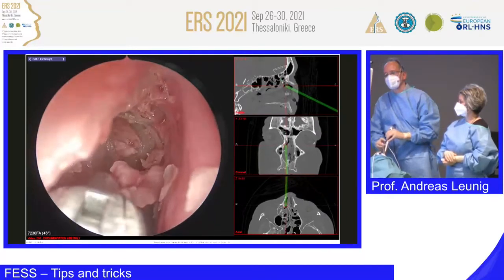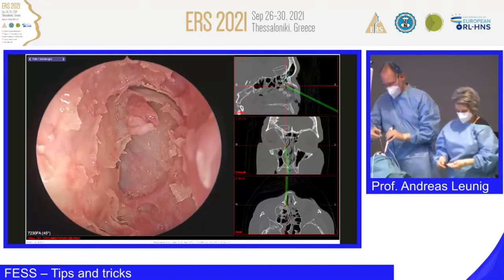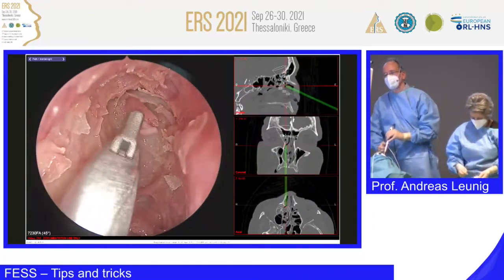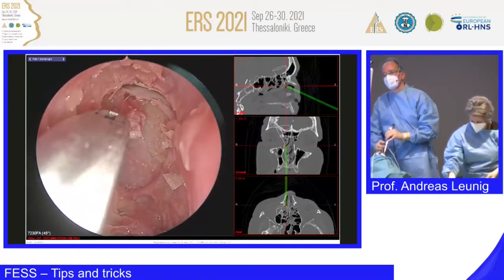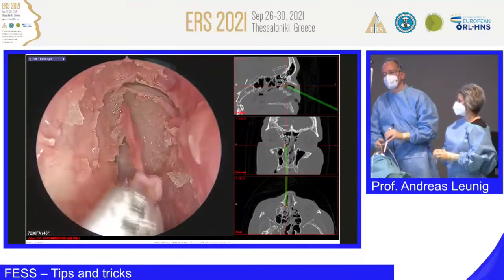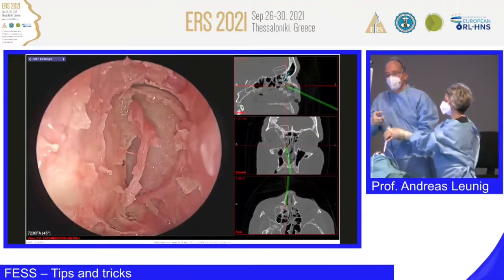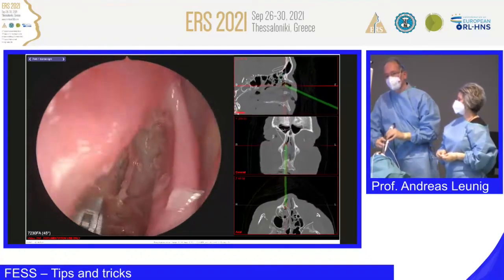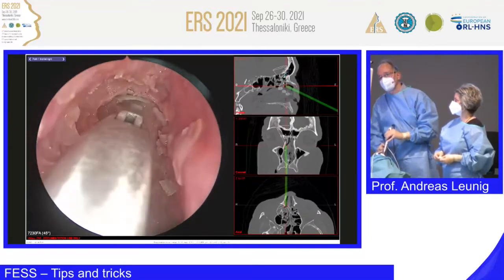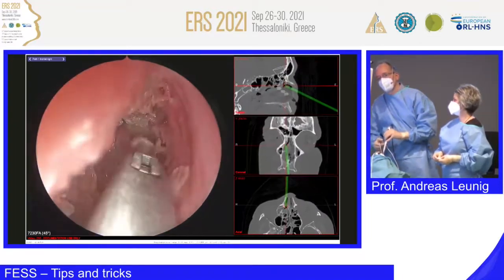You see, that's a bony lamella. It seems to be a suprabulla or even a suprabulla frontal cell, which is going very high up. Now I take the cap of this structure to expose the drainage pathway.